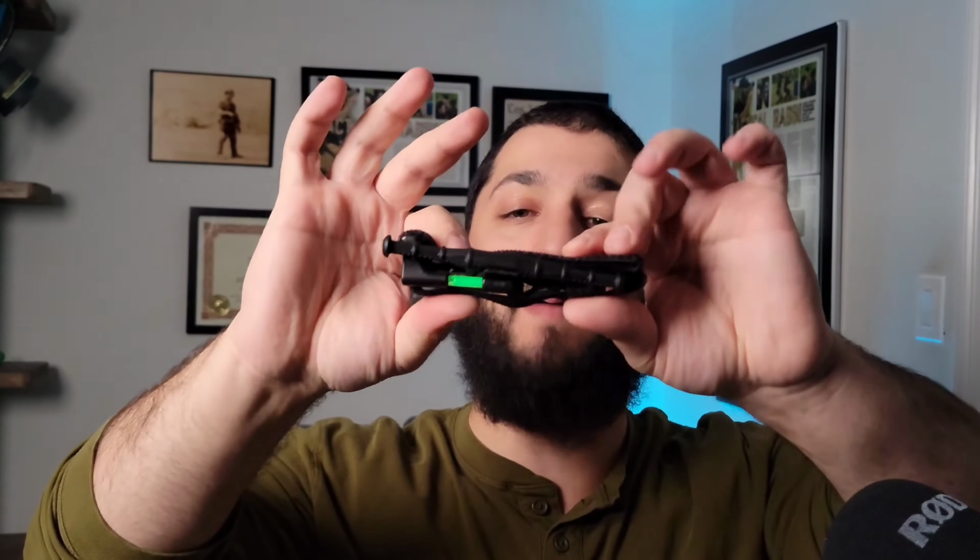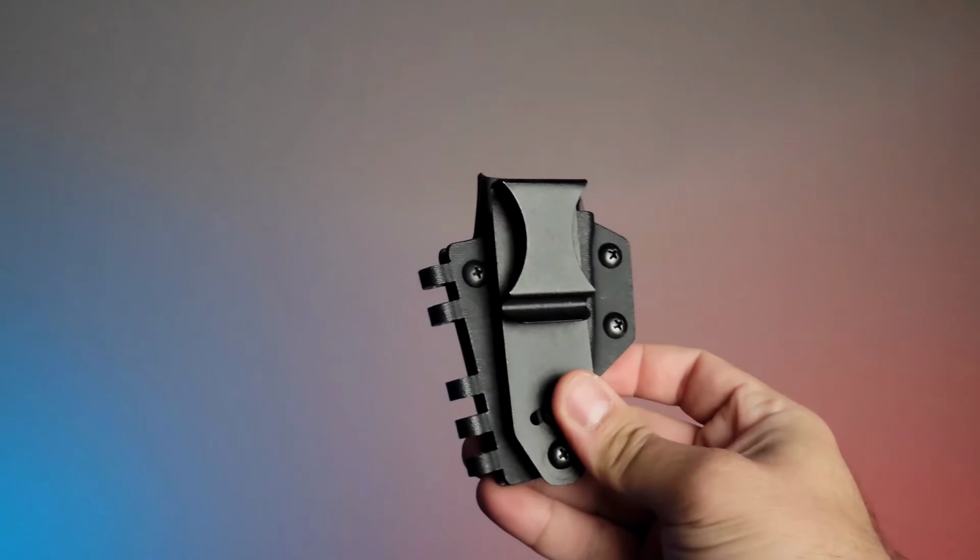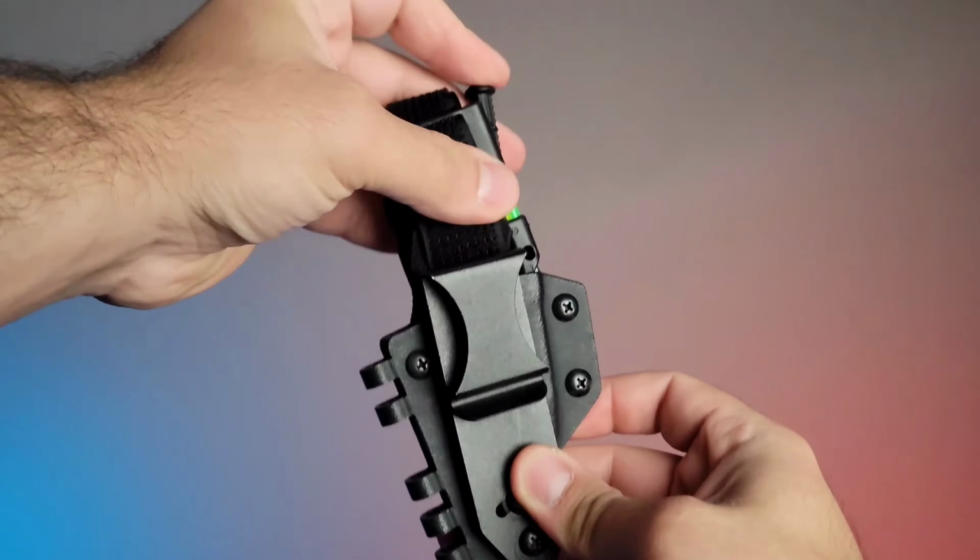Along came the ETQ. Now this tourniquet is very interesting. This tourniquet is almost the exact same thing in regards to the style of the CAT tourniquet, but they pretty much miniaturized it into a tiny little package. So much so that a big part of their advertising is that it's able to fit into a magazine carrier.